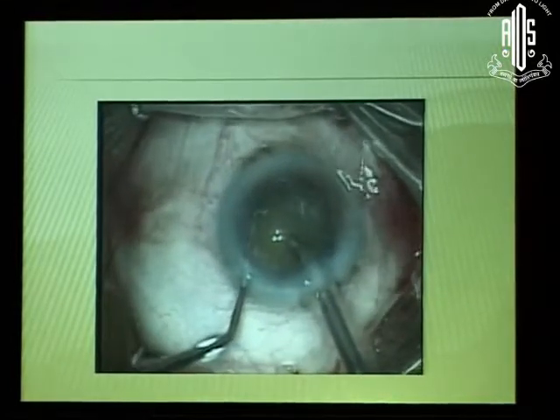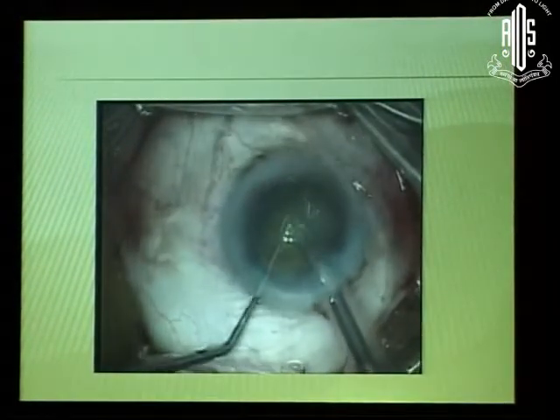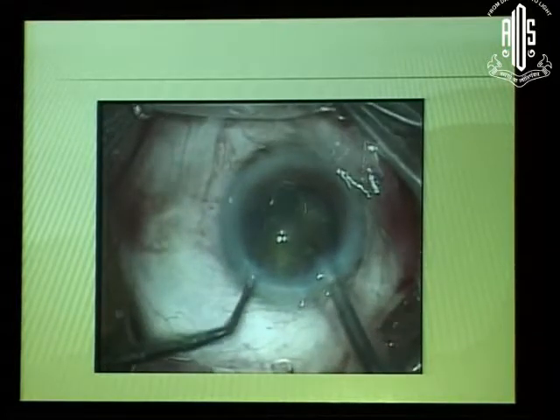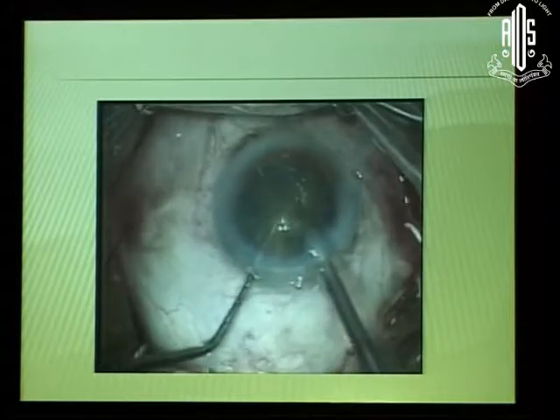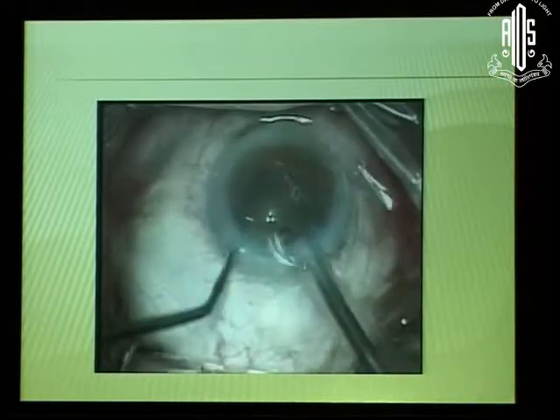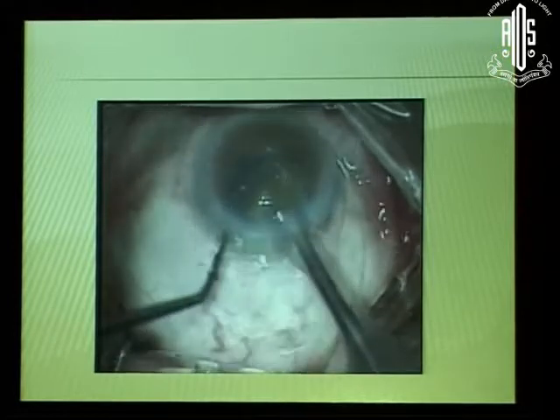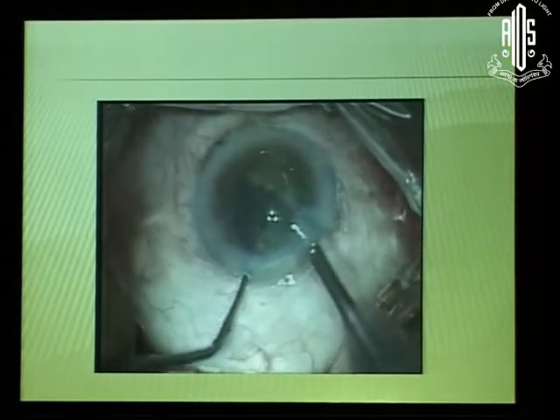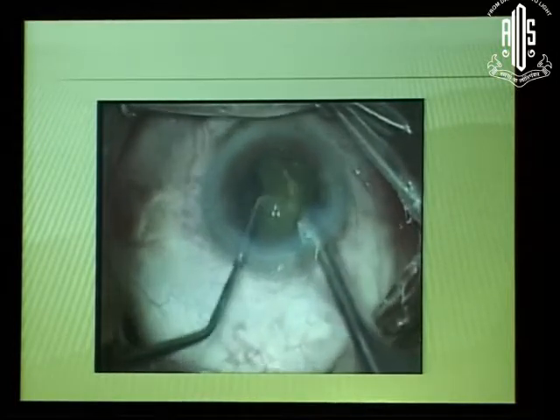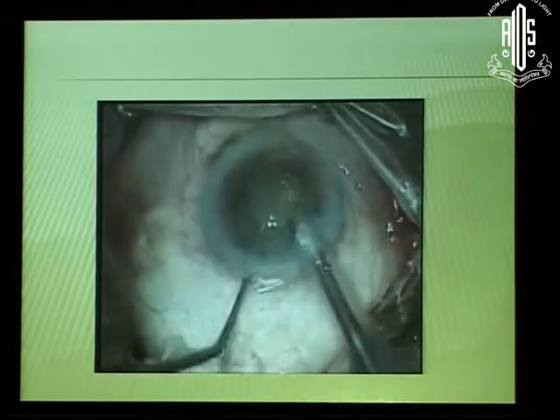You are only going to core each one individually, running all the way down. So you are only going to core each time. And each time you get a core, you get a small little opening in the middle. The advantage is every time you turn your lens around and you simply core it. Then you finally reach your final point and then you simply split your lens into 2. When you open the lens up, it is like the center of the lens is now gone. It's got an empty area in the middle, and that is the hardest part of the lens. So if you can remove the hardest part of the lens by coring it out, half your problems are gone.